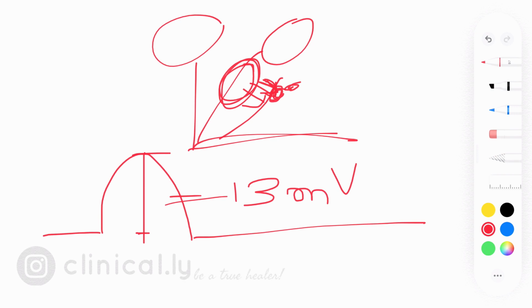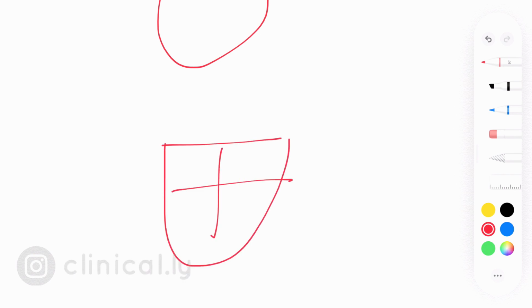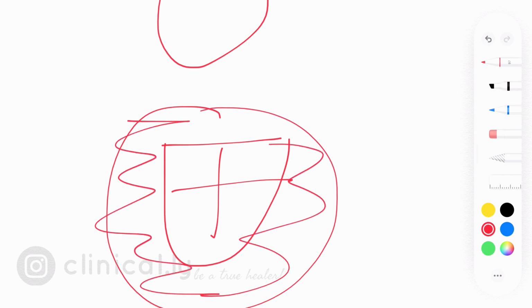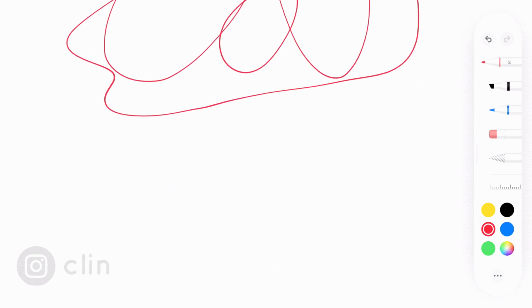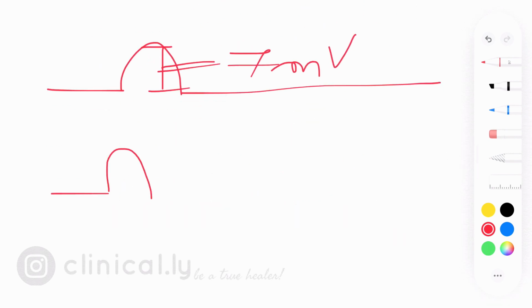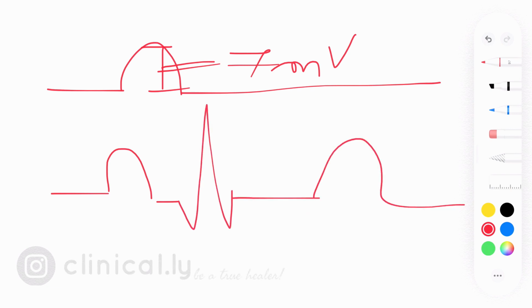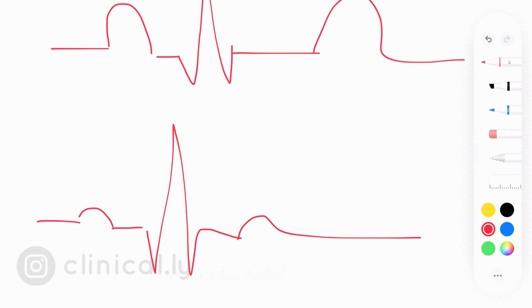Another example for that matter, if that same given patient develops a pericardial effusion, this is his heart and this is the pericardial sac, and now he gets a pericardial effusion, or these are the lungs, this is the heart, and there is a huge pleural effusion accumulating which will increase the impedance, and resultantly the P wave would be recorded at a lower amplitude. The point I am trying to highlight here is that the amplitudes, the heights of the waveform recorded in millivolts, are the perceived value of the force of the wavefront by the recording electrodes.